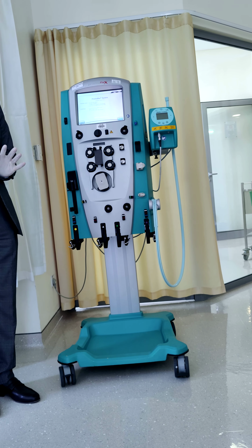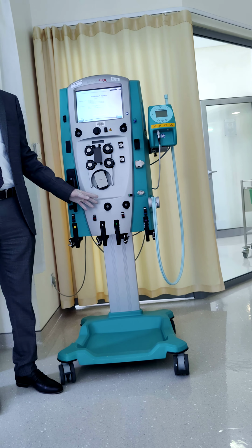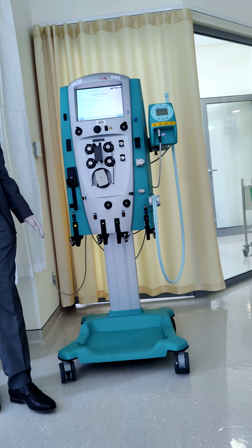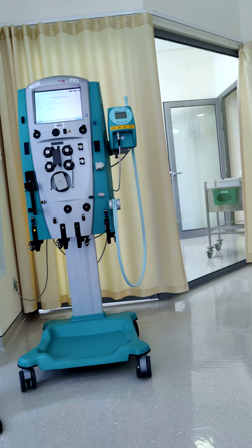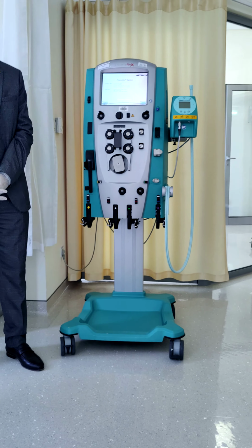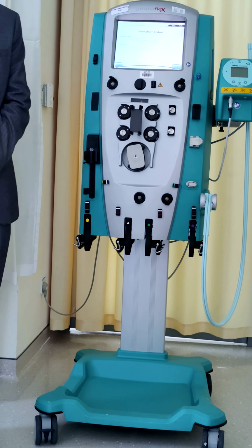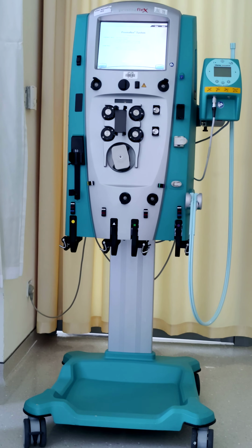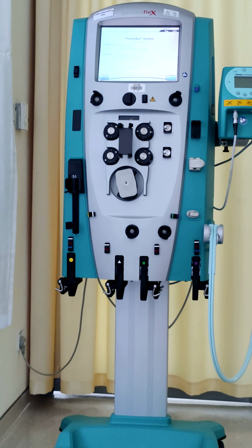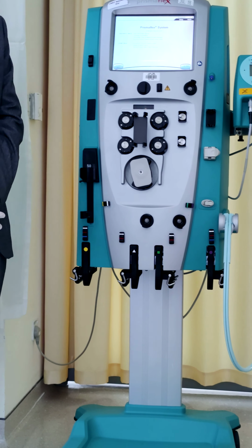Okay, important. Because one hospital called me and they put 2,000 in it. Oh my God. So the patient must have become like a balloon. Did the patient survive? Yes, but it's 2 liters, as if you give him 2 liters IV. They called me, I told them, please, this one does not return to the machine, it stays in the patient, please change the prescription, do something. Okay.